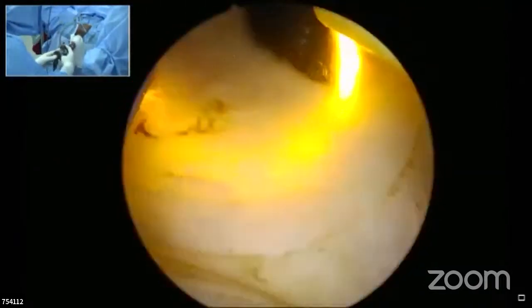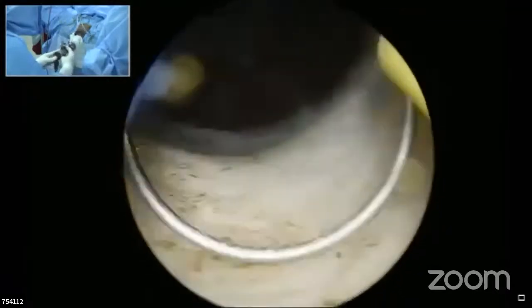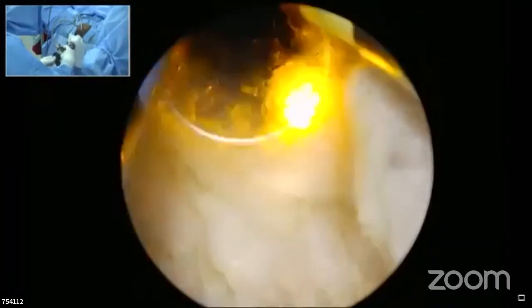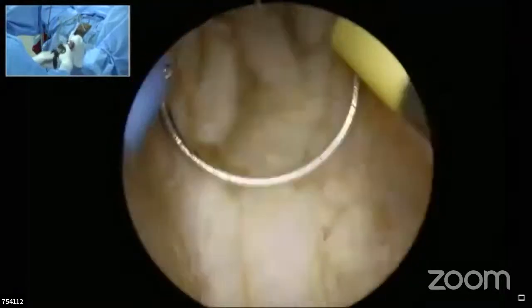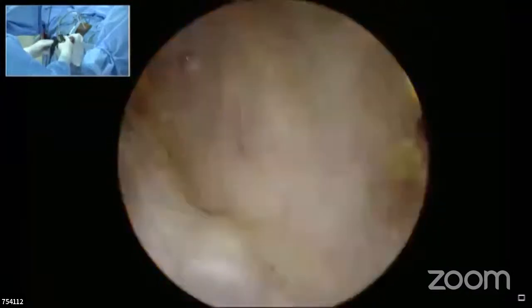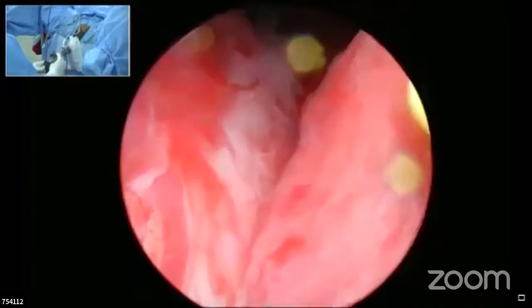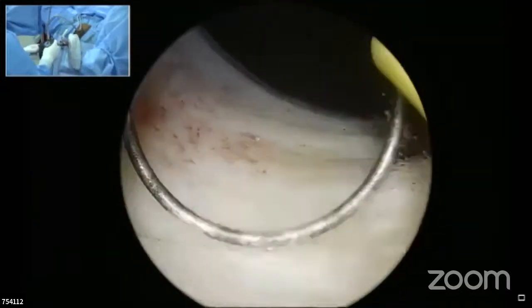But your technique of resection is taking smaller chips faster. Is that the way? Yes, sir. So I tend to rely more on the speed of the cut of bipolar and go back and have a quick point coagulation, rather than the conventional approach of a slow cut utilizing the coagulative effect of the slow movement.